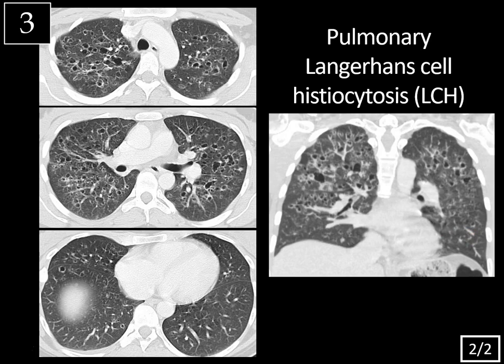One way to remember this is that centrilobular emphysema also tends to involve the upper lungs — that's smoking-related emphysema — as well as RBILD, respiratory bronchiolitis interstitial lung disease, another smoking-related disease with upper lung predominance. One of the main differential diagnoses would be cystic fibrosis, since at first glance this could look like irregular bronchiectasis. However, coronal reformats are helpful, showing that these are all individual cysts — not connected — just isolated cystic regions as opposed to a contiguous tubular structure.